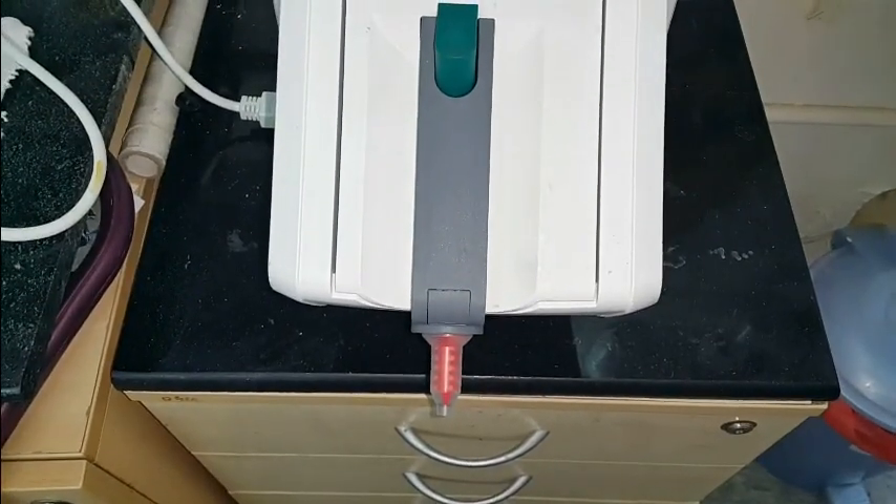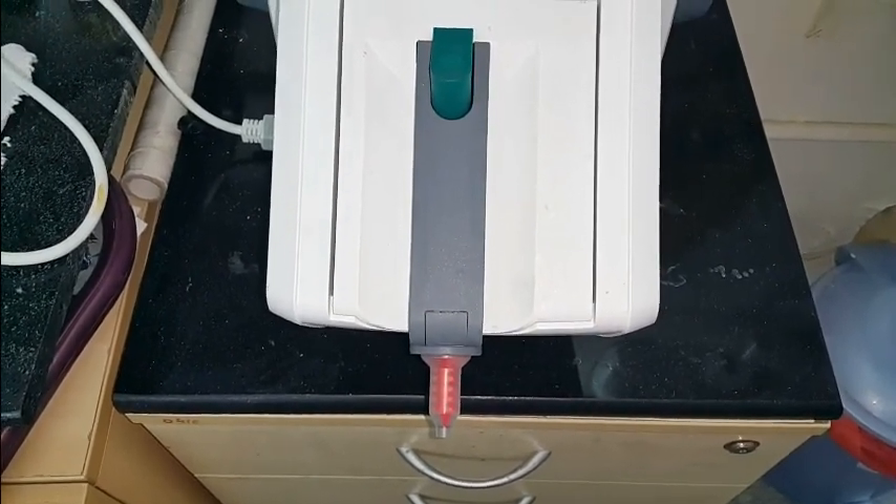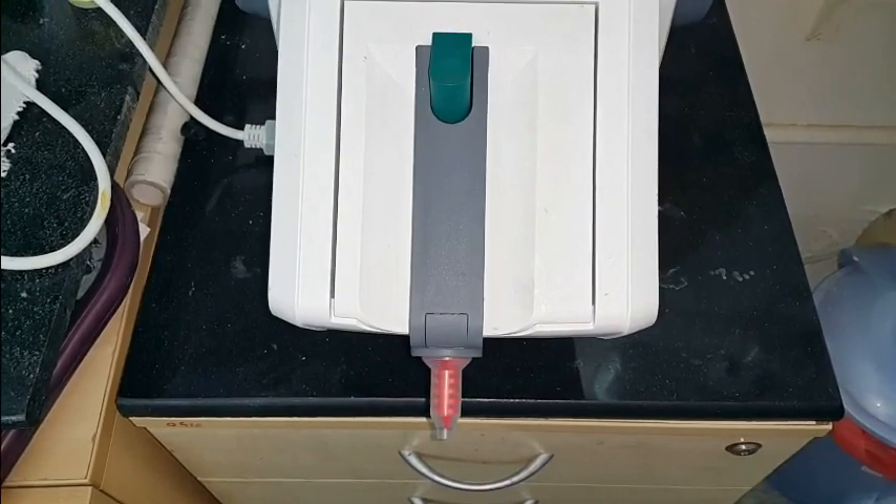For this impression procedure I am going to use this Pentamix machine where there is a polyether, which is a monophase impression material.